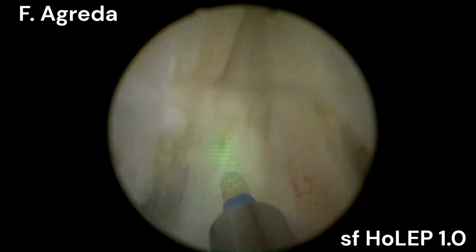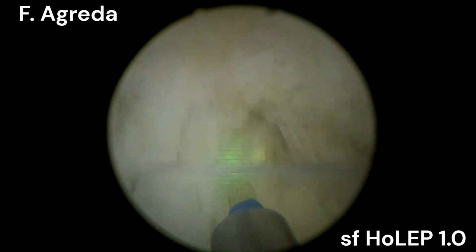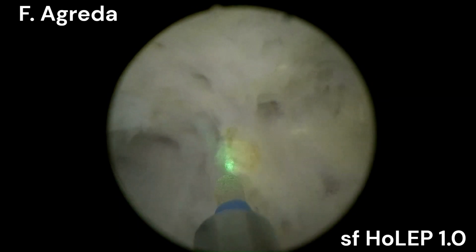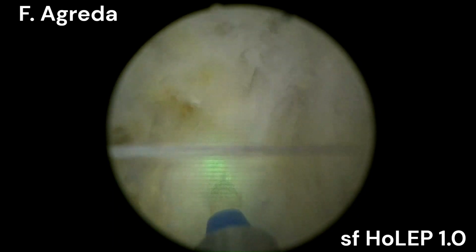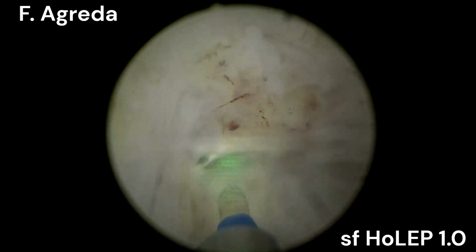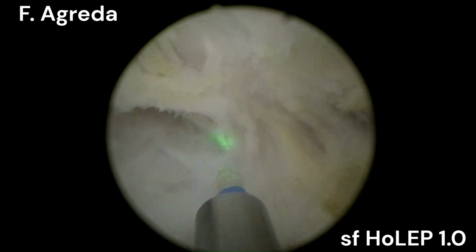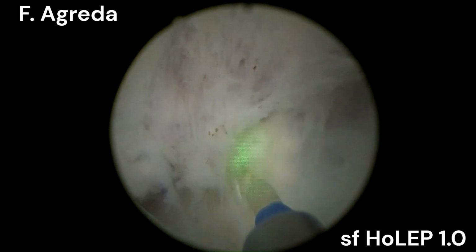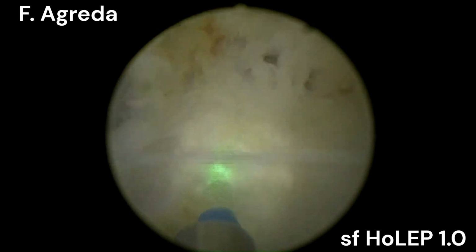Now that we have almost all lateral lobes dissection completed, we have only attached the whole adenoma by the verumontanum and a kind of isthmus between the verumontanum and the bladder neck at around 6 o'clock position. So now, as a final step, and after the prostatic arteries have been controlled, I do this last retrograde dissection to complete the liberation or releasing of the adenoma into the bladder.